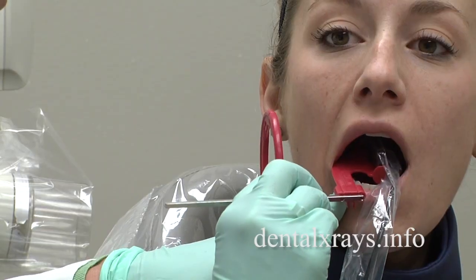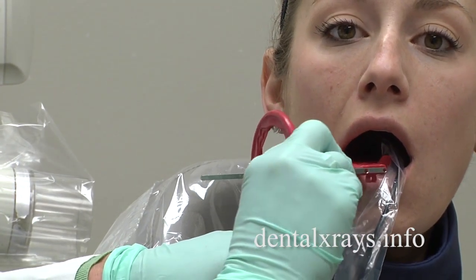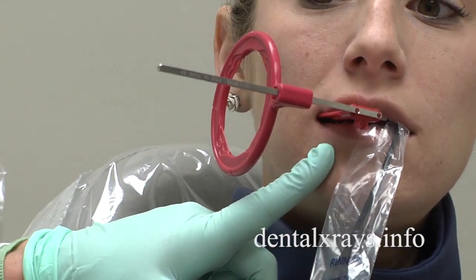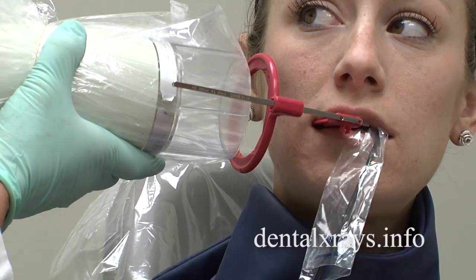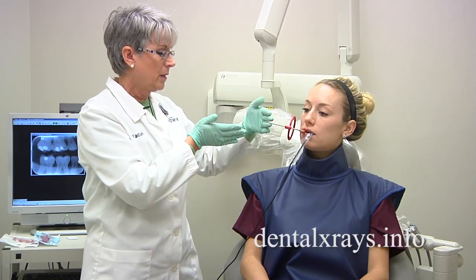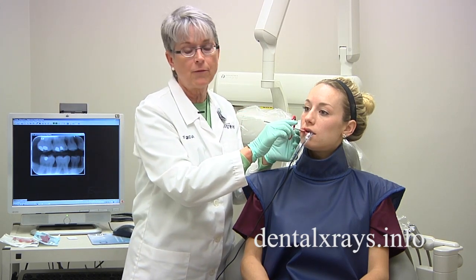So what we have to do is put it toward the middle of the mouth and then what I call a cross arch — I'm twisting it in the mouth and having her bite down. However, you cannot take the x-ray just like this because if I would take this while it's twisted in the mouth, it's a paralleling technique and the horizontal angle is going to cause overlap.